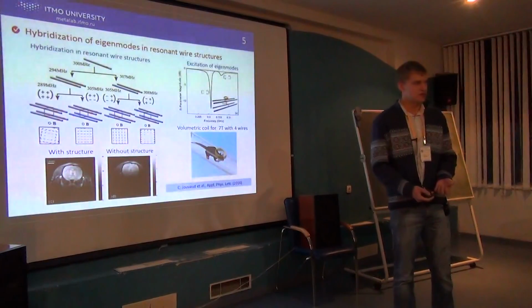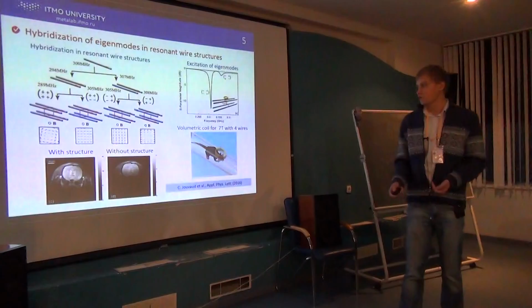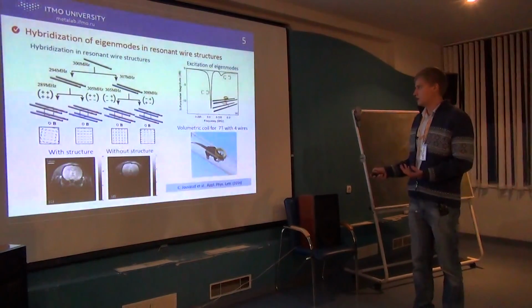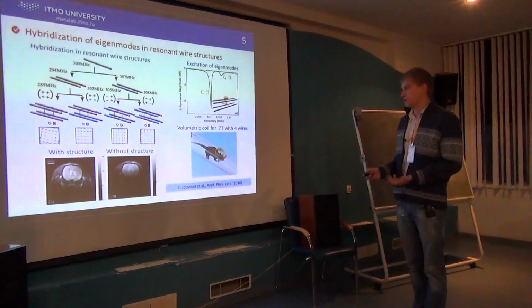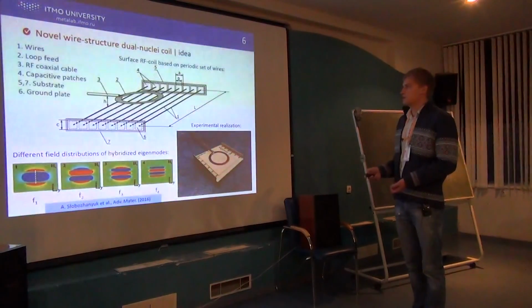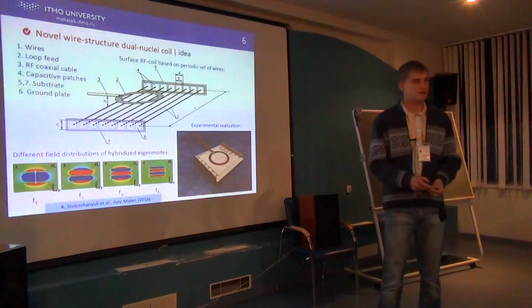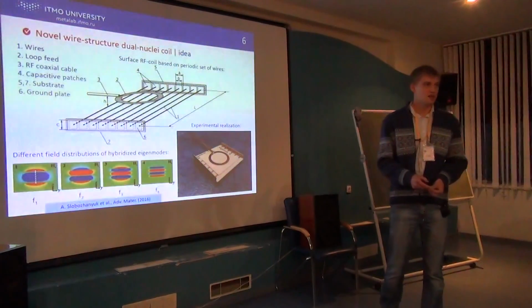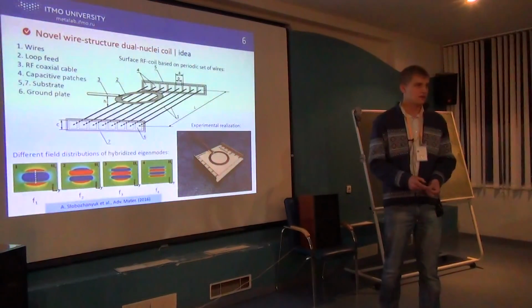And in principle, we can make a coil for 4 frequencies out of this design. This kind of coil for 7 Tesla for preclinical imaging was done by our colleagues from France earlier this year. And in our case, we would like to scan at 2 frequencies simultaneously. First frequency is the frequency of proton. At 7 Tesla, it's around 300 megahertz, and another frequency is 282. It's the frequency of fluorine at 7 Tesla.